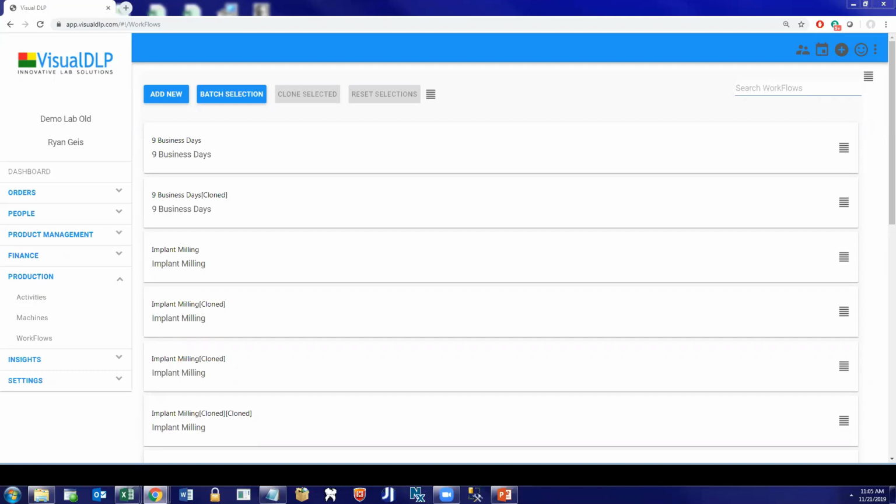I'll chime in, David, a little bit. I could say that, let's say we were going to send something to China, we would just build in X days. But if it was one of our sister labs, it'd be nice to be able to not have to have a second case. Or if there was a second case at our sister lab, that there would be some connection between the two. Yeah. Right, without them logging into the same system. I see what you're saying. So we're sort of porting the case into a new system, but flagging it as a... Yeah, let me see.